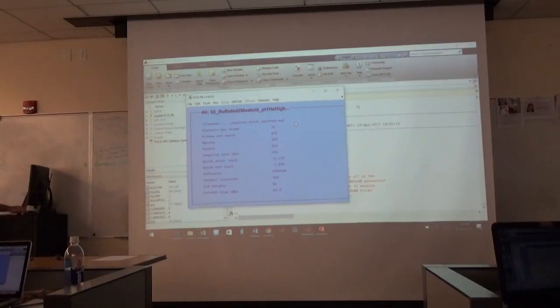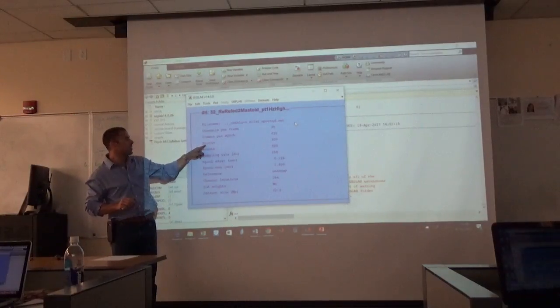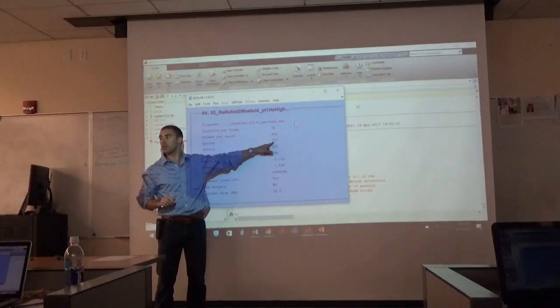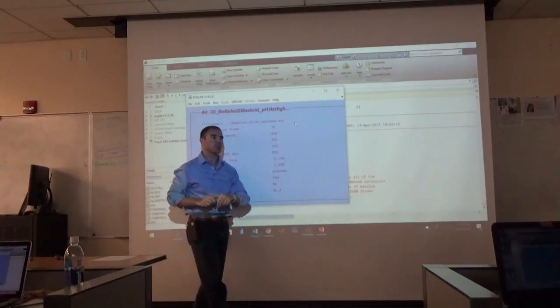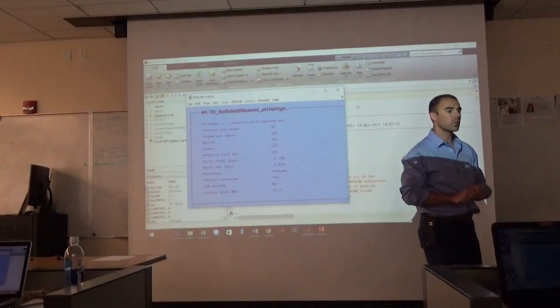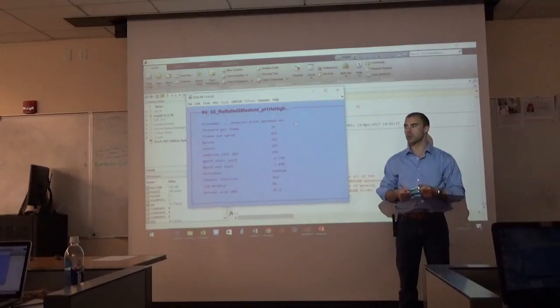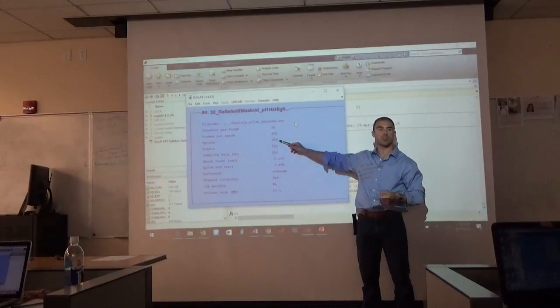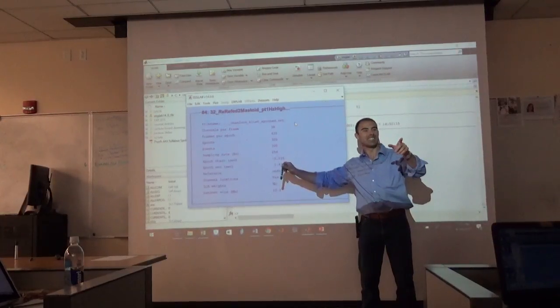Okay, so now that we did that, we just epoched the data. Does everybody have a GUI that looks like this that says epochs of 300? Let me ask that the other way. Does anybody not have a GUI that has 300 epochs? Just to clarify, copy and paste the name into the save as file box. But you want to make sure that you browse as well and put it in the right folder too, just the data with EEG. Okay. So does anybody not have a GUI that looks like this? Seriously, everybody this worked for? We might have just made history in this class. That's awesome. Oh, except the hand, which is okay. But mine just doesn't want to save it to the EEG list.